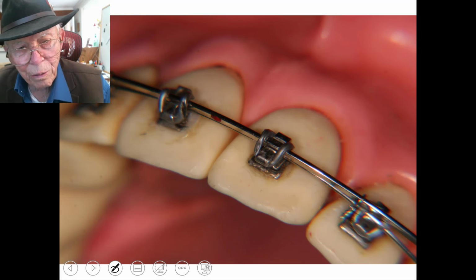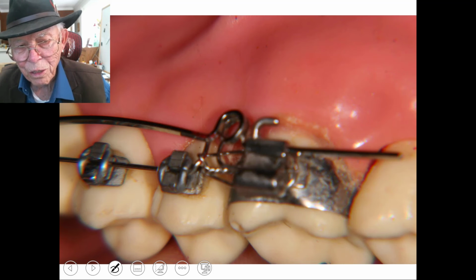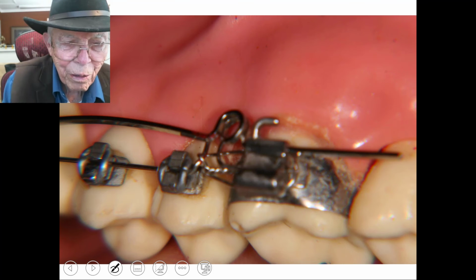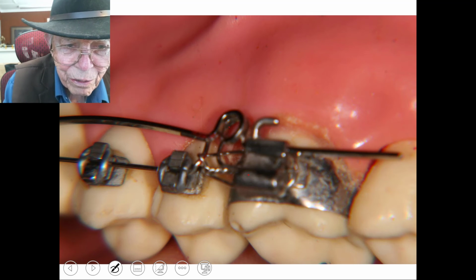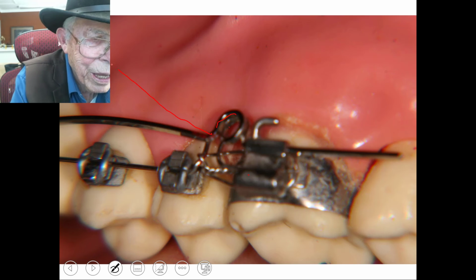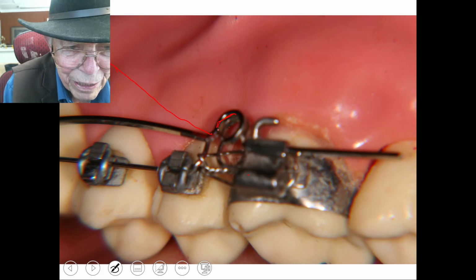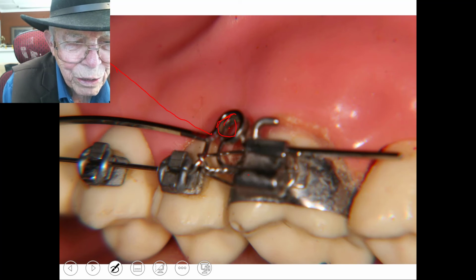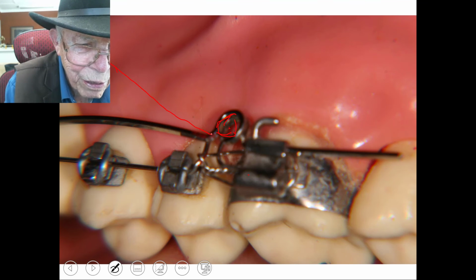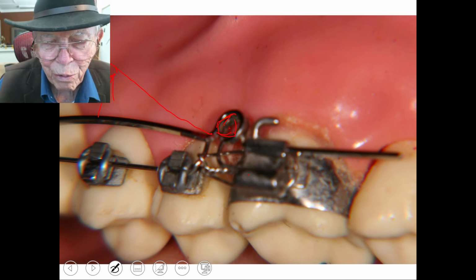Now, there we've got it tied in, and this is the end of it. We tie the arch wire back. This is the intruding wire right here, and this was the activation. As we pull this down, it tightens this loop up, and this loop is trying to loosen itself, so it's wanting to raise this up, and that's exactly what it does.